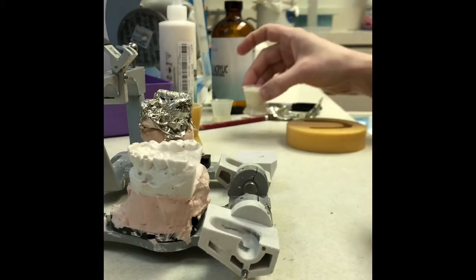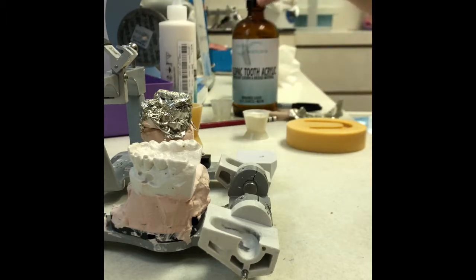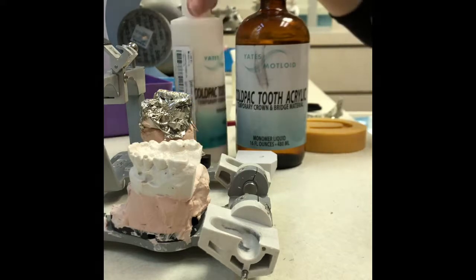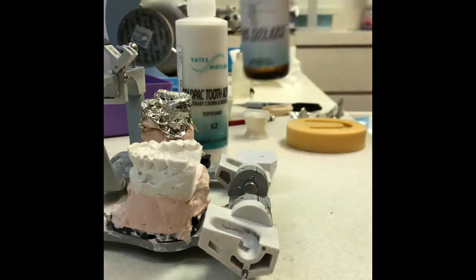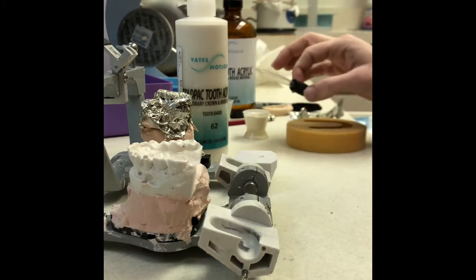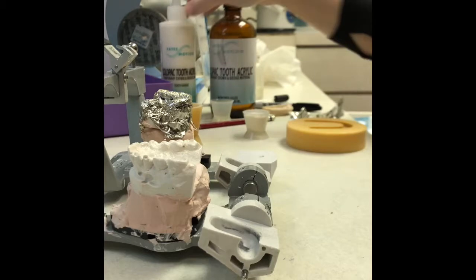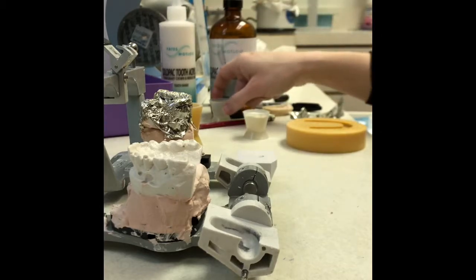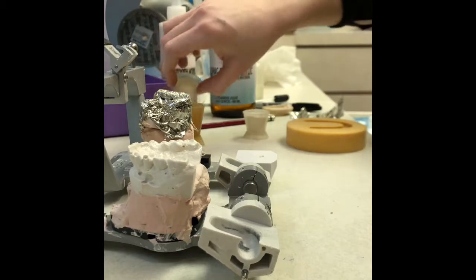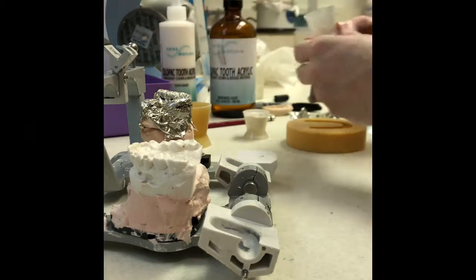We use these smaller Dappen dishes, and here's the monomer, and here's the powder. To get this out of here, we use the dropper. Don't ever try to pour it; it won't pour well. So we use this dropper, and we use one liquid to two powder. So pour this in the larger mixing dish here.